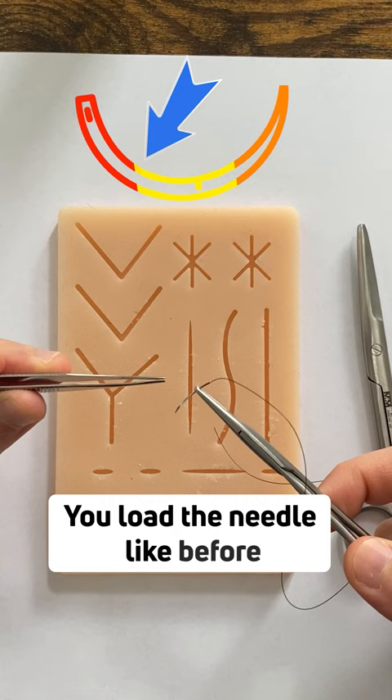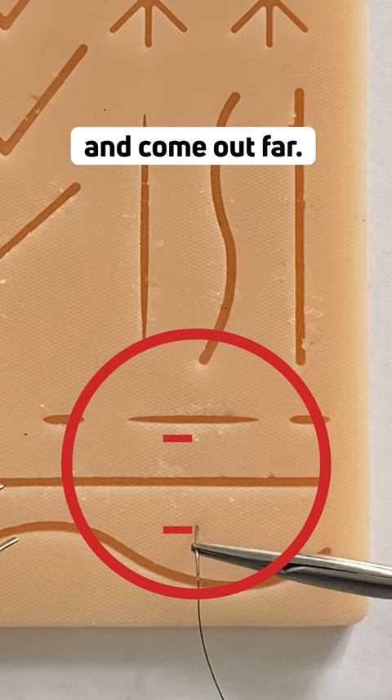You load the needle like before, between the upper third and the middle third. Now we're going to go in far and come out far, and then go back in close and come out close on the other side.